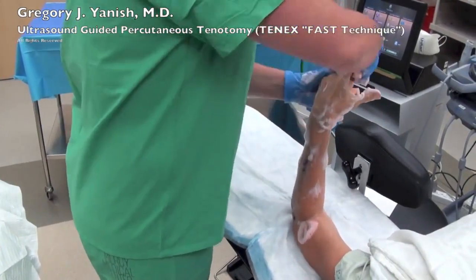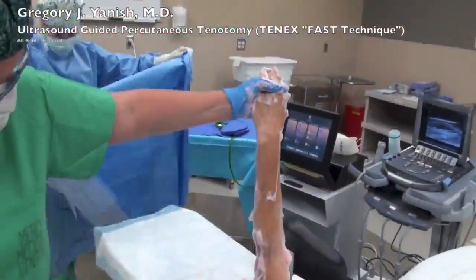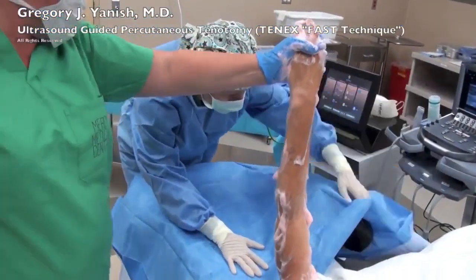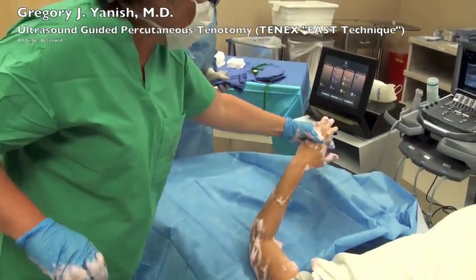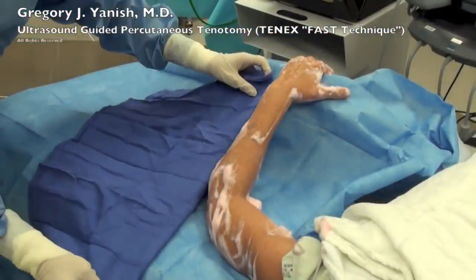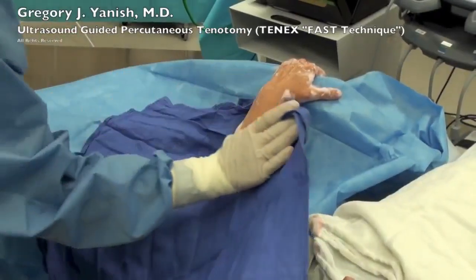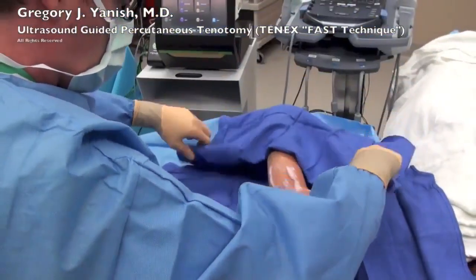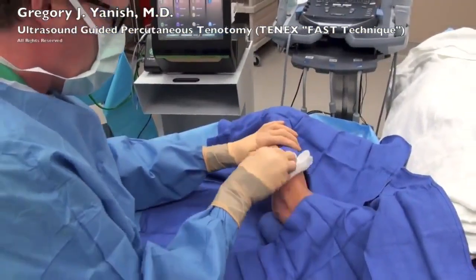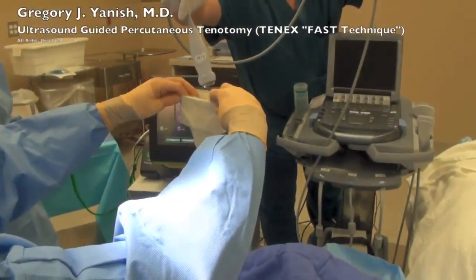Patient's arm is being prepped with chlorhexidine or Hibiclens, and the operating room nurse will set up a sterile field using sterile drapes and towels. Once the sterile field is in place, I will find my anatomical landmarks and begin the procedure.